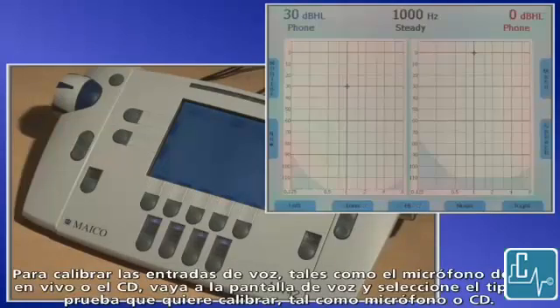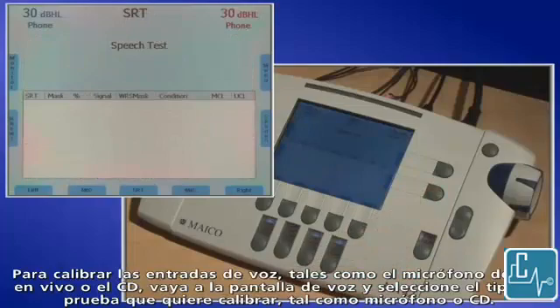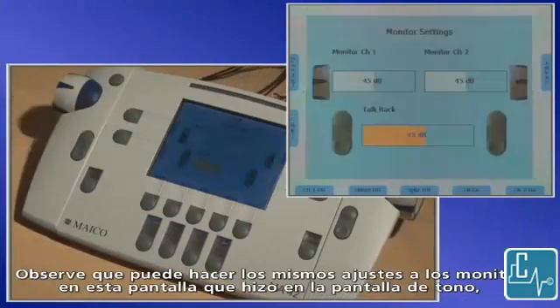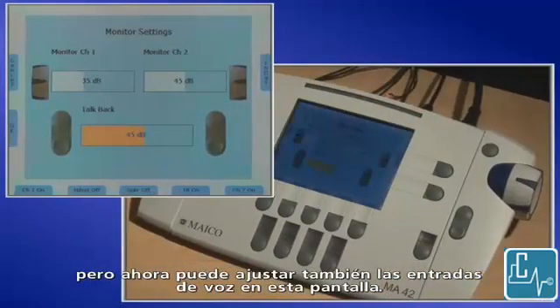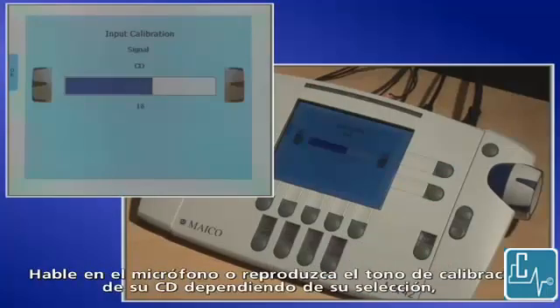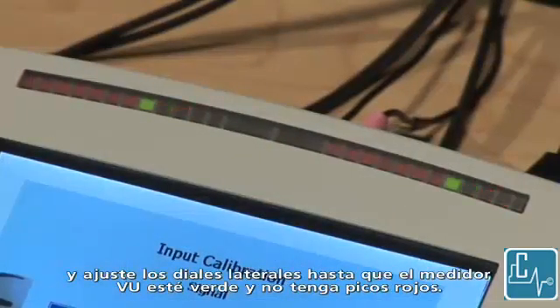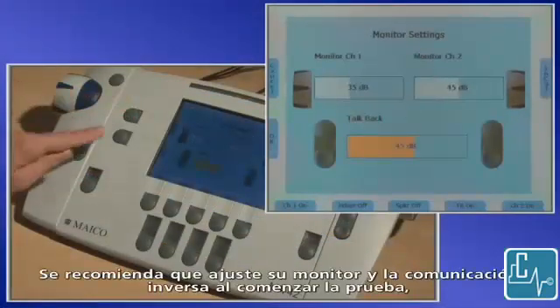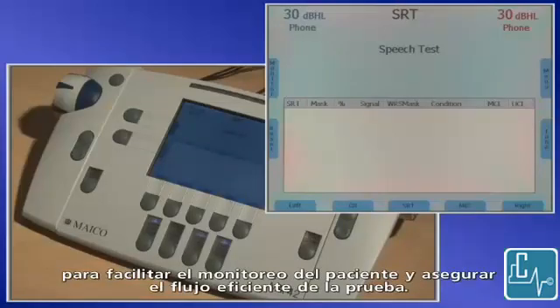To calibrate speech inputs such as live voice mic or CD, go to the speech screen, then select the type of test you want to calibrate such as mic or CD, then select monitor. You can make the same adjustments to the monitors in this screen as you did from the tone screen, but now you can also adjust speech inputs as well. Select incal to adjust the input calibration. Talk into the mic or play the cal tone on your CD depending on your selection, and adjust the side dials until the VU meter shows green and is not peeking into red. Press OK to save your settings. It is recommended that you adjust your monitor and talkback settings at the very beginning of the test to ensure ease of monitoring the patient and an efficient flow of testing.